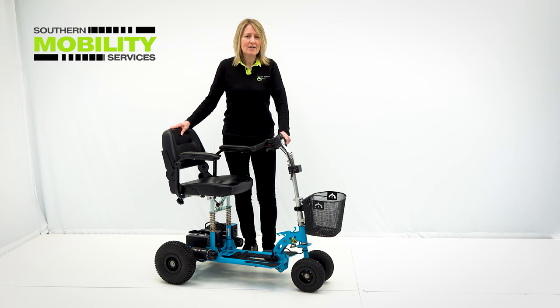So now you've seen what it looks like, let's go outside and see how it performs.